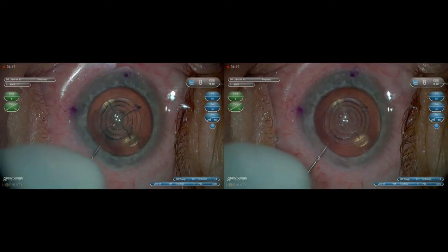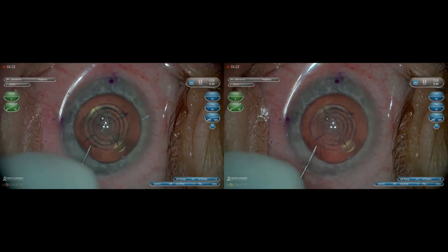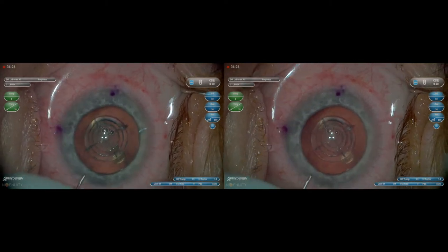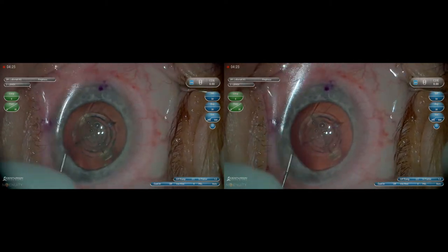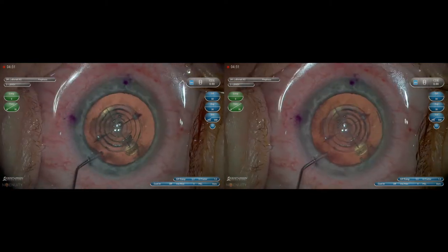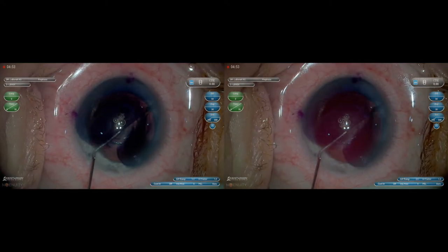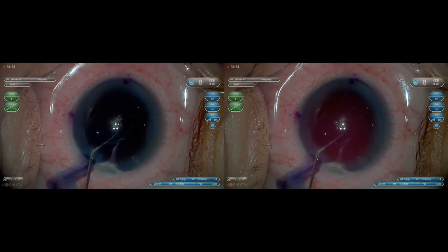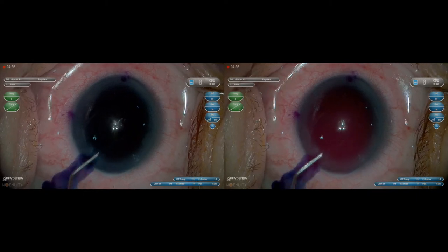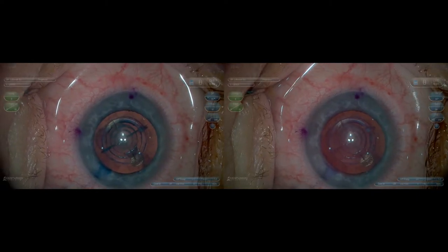I can keep it in one position and see the different tissue planes necessary. This becomes most powerful while I'm working in the nuclear component of the cataract, seeing the front and back of the lens. You can see the anterior capsule, and in the bottom corner you can see that air bubble, which is obviously the posterior capsule as well.